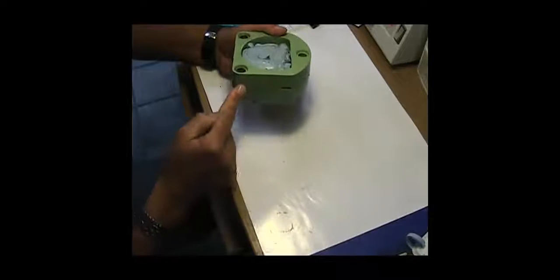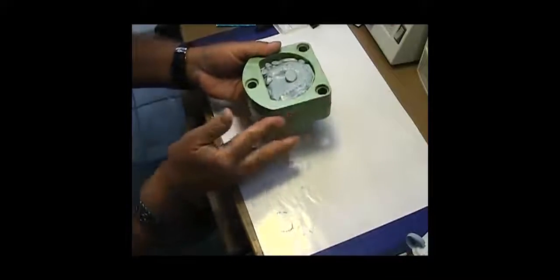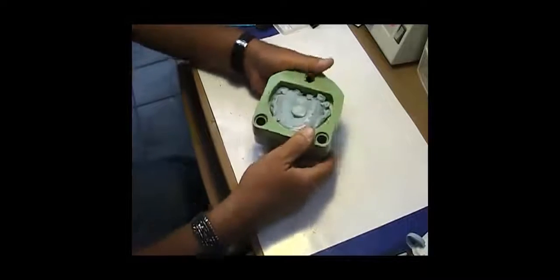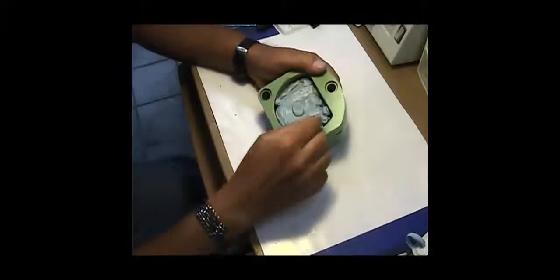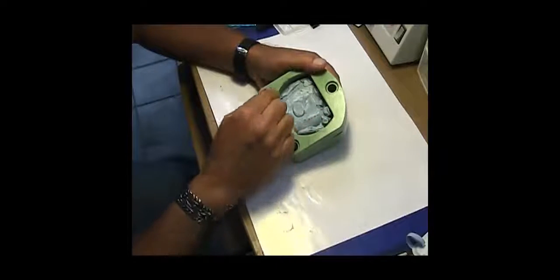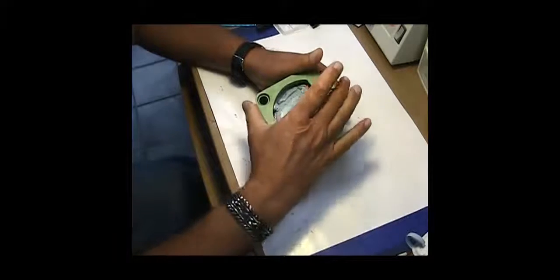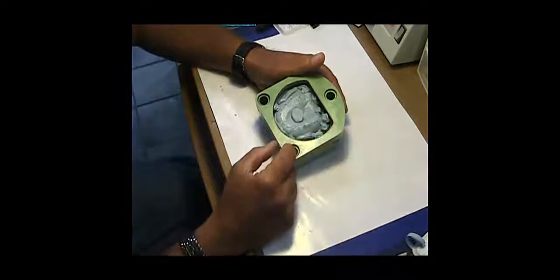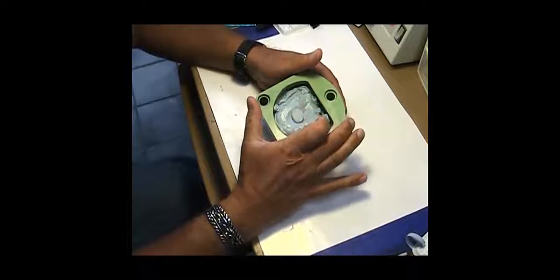We would call it metal to metal if it was a metal flask, so we'll say it's plastic to plastic because this is a plastic flask. Because it's tight in this area, I'll pre-pour some stone in and around here before I put the cap on and screw the bolts down.